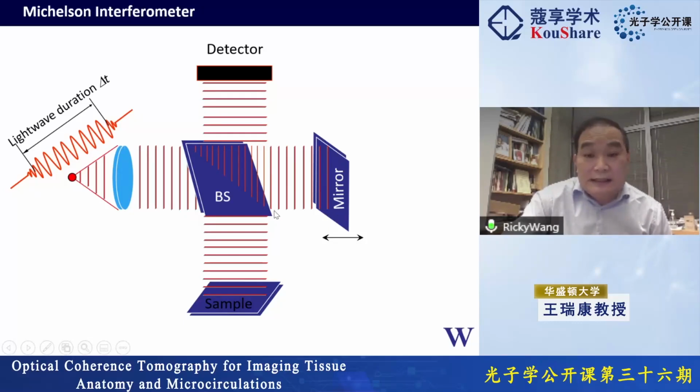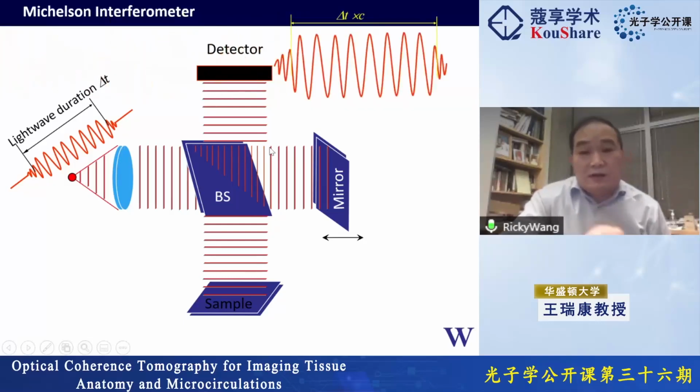And then you can see the interference of the signal, or basically the signal mixing of the light in the beam splitter, okay? For example, the system is set up, and you can use the photodetector to detect the signal mixing of the light. Signal mixing is called, in the optics field, interference, okay?